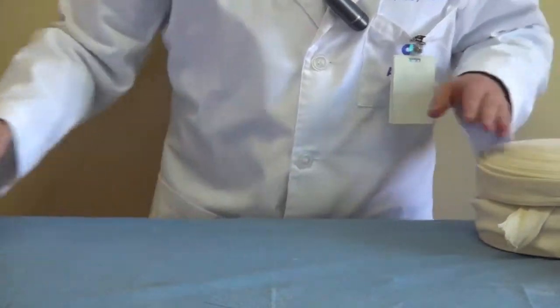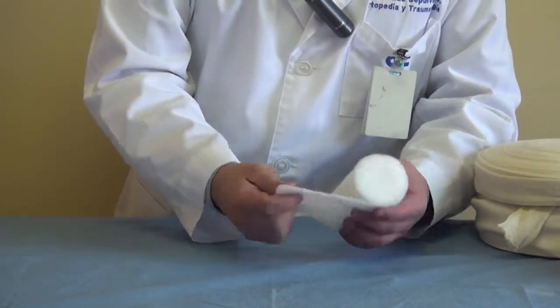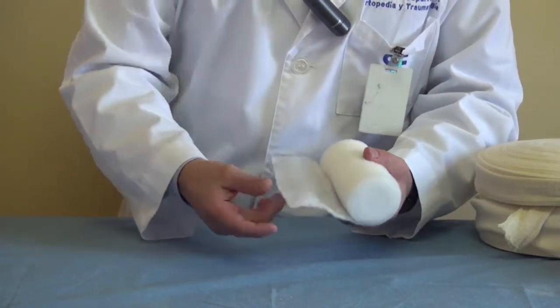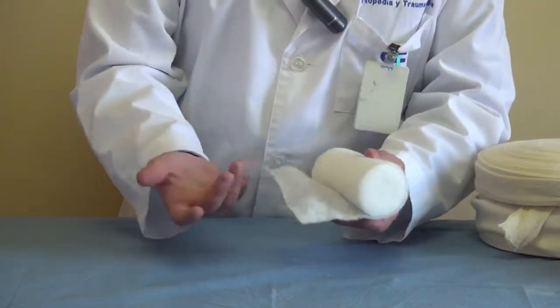After the tubular stocking, you have to put some protection — some padding around the bony eminences principally. For this you can use this kind of cotton tissue. There are some plastic ones, but anything that can protect the eminence is good.